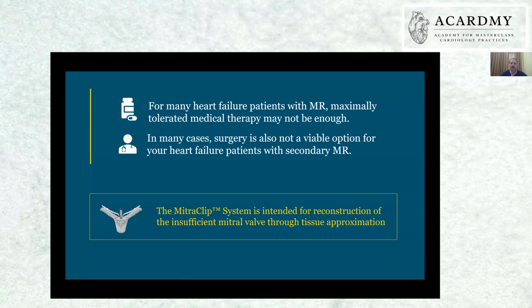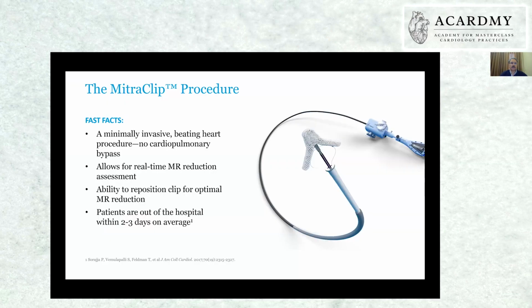In many cases, these patients usually have an ejection fraction of 15, 20, 25%. So there is going to be very high morbidity and mortality in any surgical intervention. That is where the Mitraclip has a role. So this is the device, how it looks. We only have the Mitraclip as of now.